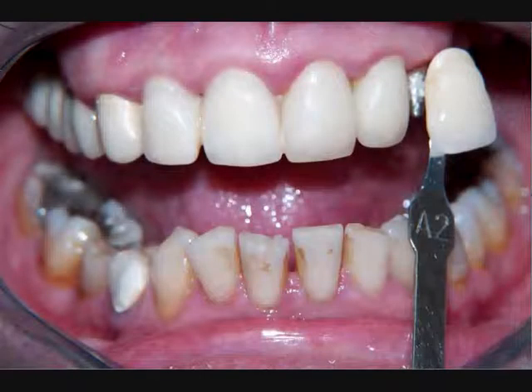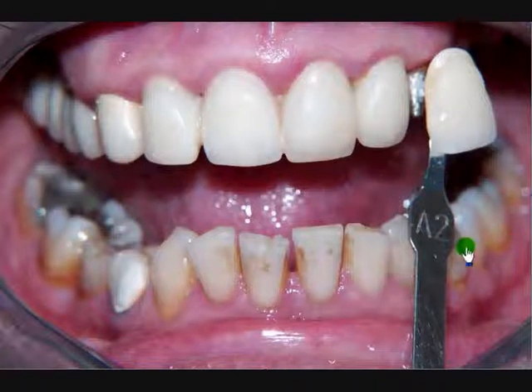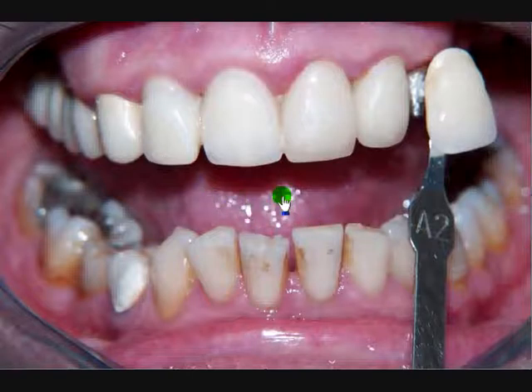Digital pictures can be an important source of information if we are able to spot this information and transfer it through the workout of the materials all the way down to a finished medical dental device. In this first picture, there could be so many elements to take into consideration.